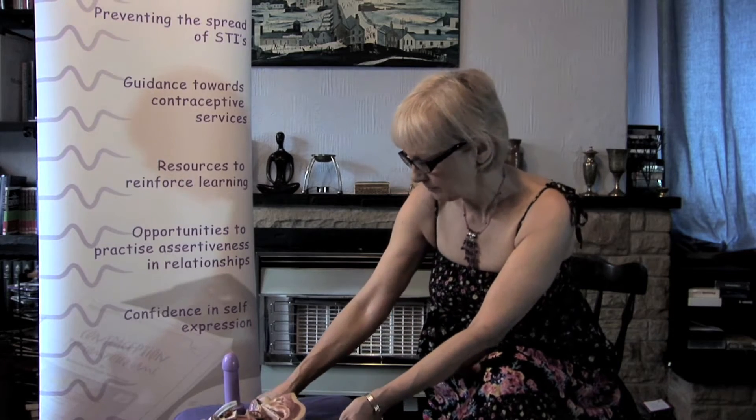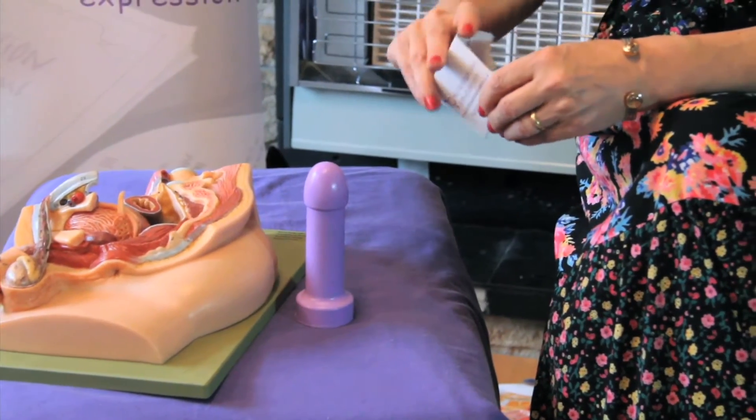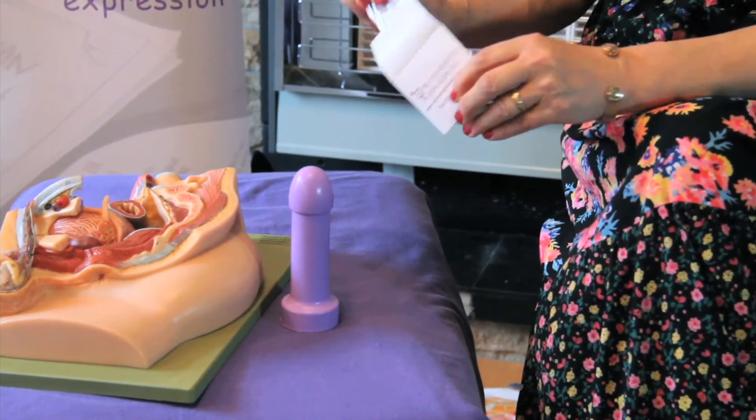So what I'm going to show you is how the condom works, and I'm going to do a demonstration. I'm going to take the condom demonstrator and use an ordinary condom.